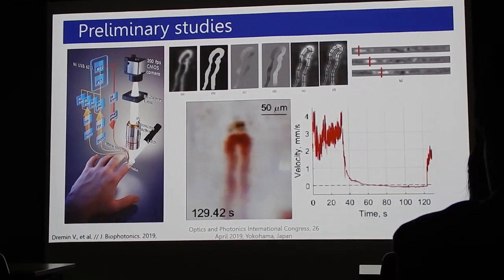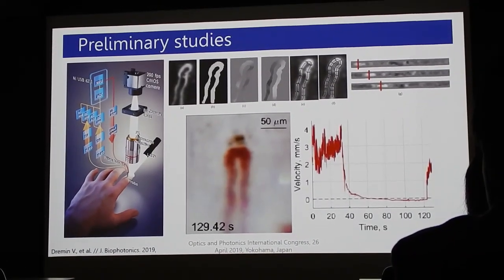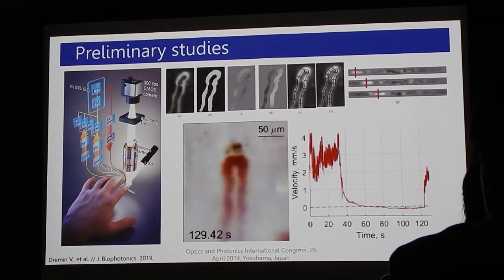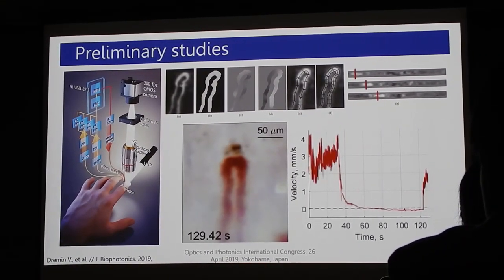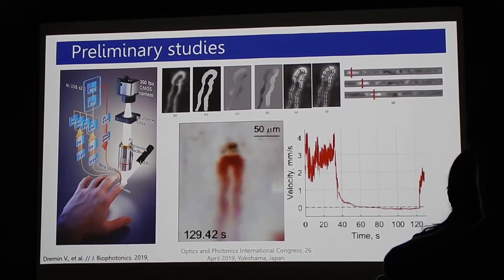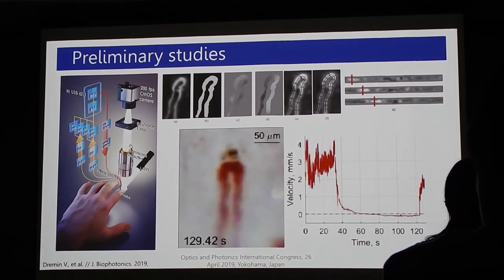It's a graph of blood flow velocity in a single capillary. It was shown that these two signals, recorded by Doppler Flowmetry and video capillaroscopy, are proportional to each other, which proves that the Doppler Flowmetry signal is largely dependent on the blood flow velocity in capillaries.